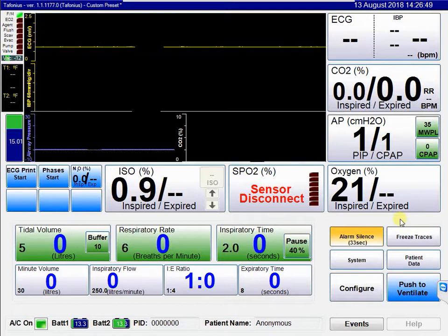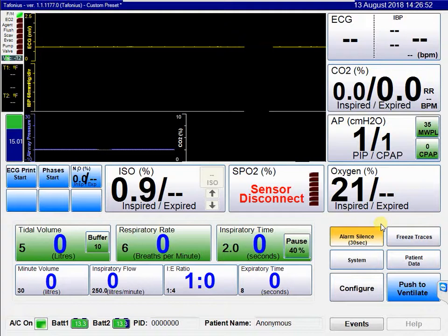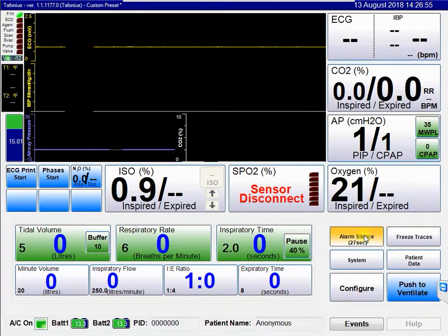When the 60 seconds has elapsed, the alarm silence button will return to normal. If you click on it at any time, it will go back to its normal state.